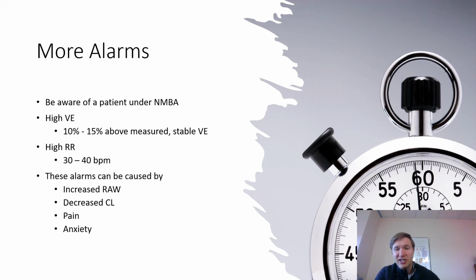The big disadvantage, if that patient becomes disconnected, oh heavens, right? You're going to have a big issue because they can't breathe on their own, right? We stop that altogether with that neuromuscular blockade. So your high minute ventilation, high respiratory rate, those alarms, so now new subject, right? We talked about neuromuscular blockade. Those are your low pressure, low minute ventilation, low tidal volume, all those things that would indicate a leak or disconnect or hypoventilation, right? You want to make sure those are good.